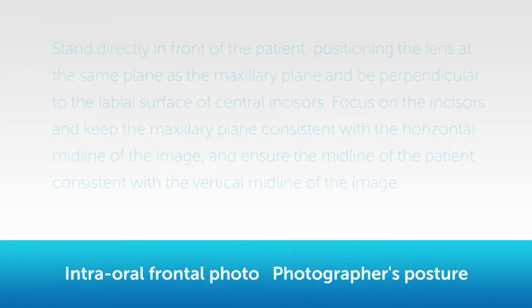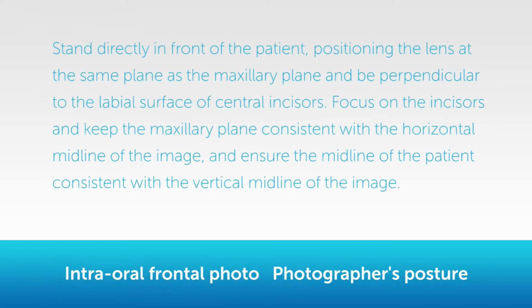Intraoral frontal photo. Photographer's posture. Stand directly in front of the patient, positioning the lens at the same plane as the maxillary plane, and be perpendicular to the labial surface of central incisors. Focus on the incisors and keep the maxillary plane consistent with the horizontal midline of the image, and then show the midline of the patient consistent with the vertical midline of the image.